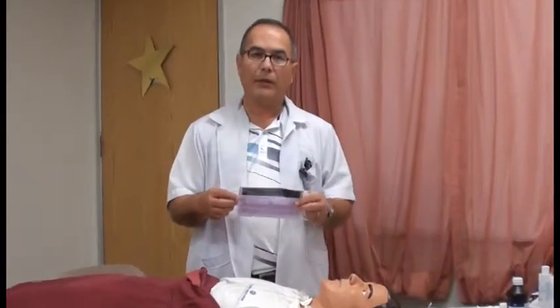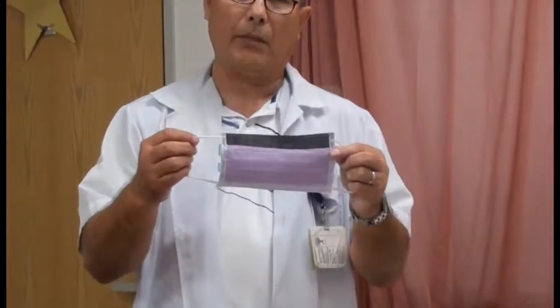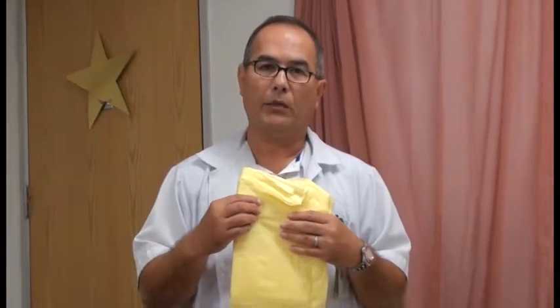Some of the equipment we'll need is, first of all, if you suspect the patient has any type of respiratory infection, then you should put your protective equipment on, such as a mask. But today I'm not going to use that so you can hear me and I'll be more understandable. You can also wear an isolation gown to protect yourself from any secretions or drainage from the tracheostomy.